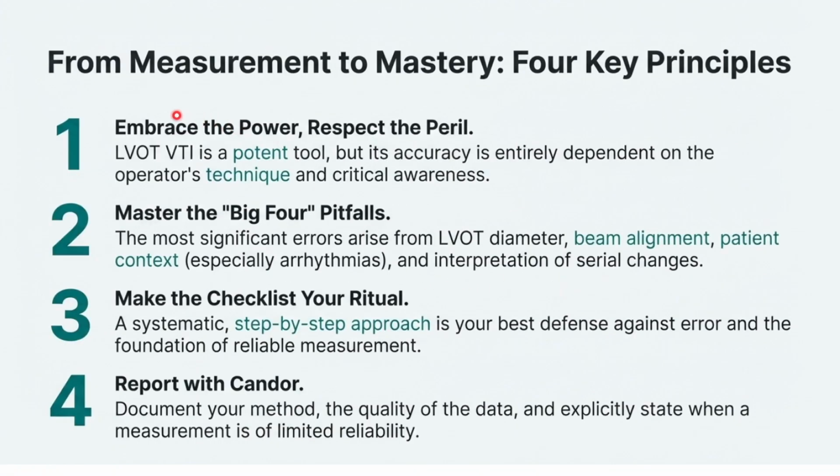So from measurement to mastery, the 4 key principles that we need to consider. First of all, embrace the power and respect the peril. So LVOT VTI is a potent tool, but its accuracy is entirely dependent on the operator techniques and the clinical and critical awareness. Master the big 4 pitfalls. We talked about those pitfalls, and also we talked about how to address them.